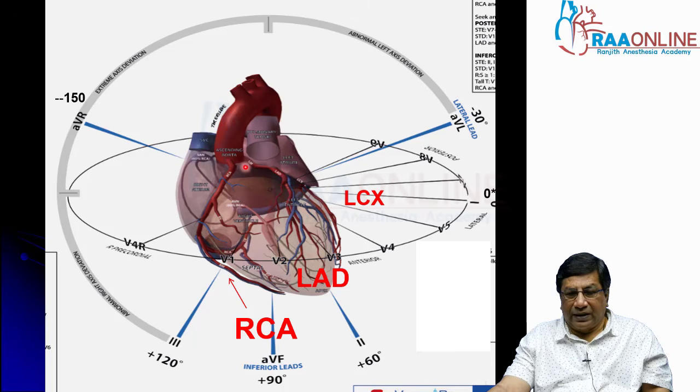Whereas the left anterior descending artery, which is the most important artery, is running in the anterior interventricular groove, represented by the leads V2, V3 and V4. It is going to supply the anterior wall of the left ventricle as well as the interventricular septum. That is why it is the most crucial artery, because it supplies the bulk of the main ventricle, which is the left ventricle.